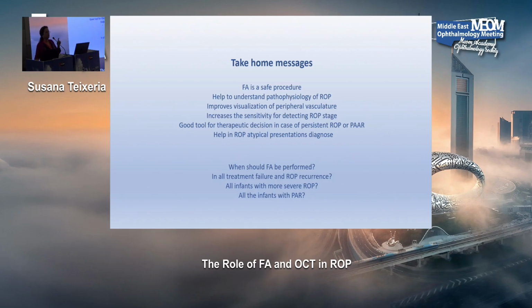You don't need just those very expensive machines. You also have nowadays Indian and Chinese very good machines that are not so expensive and can help you in your way through ROP.